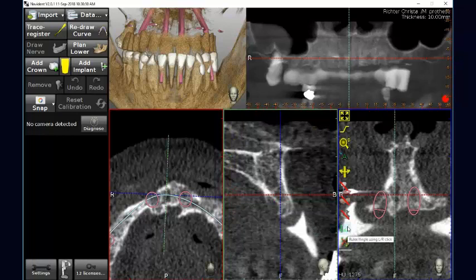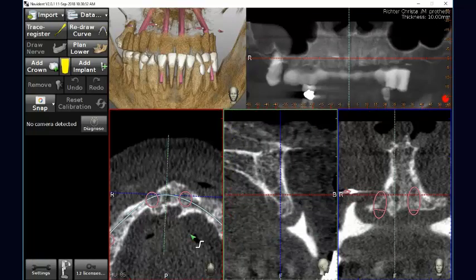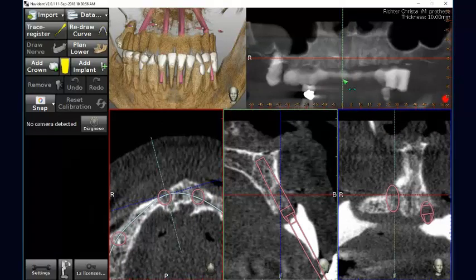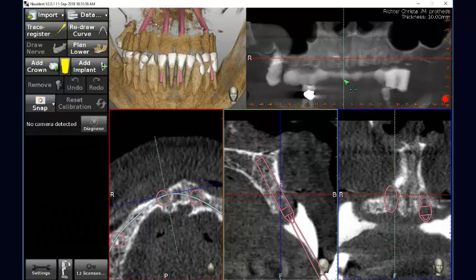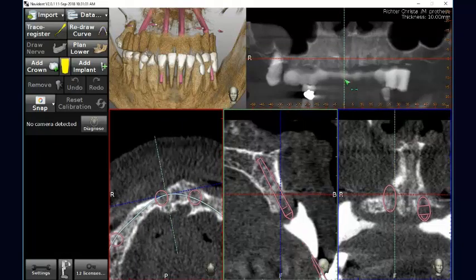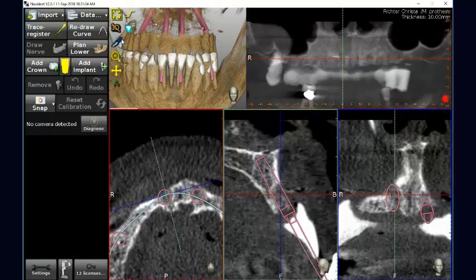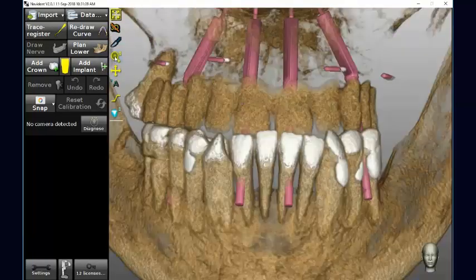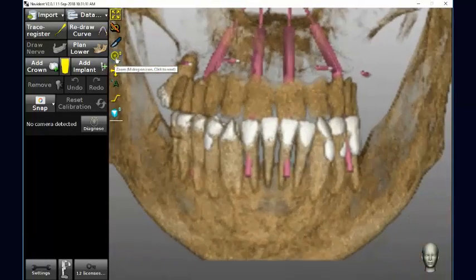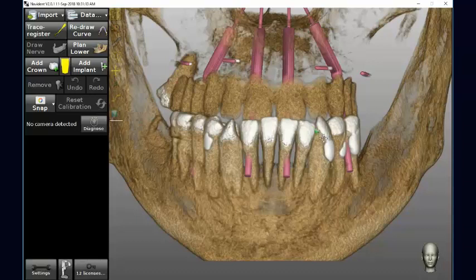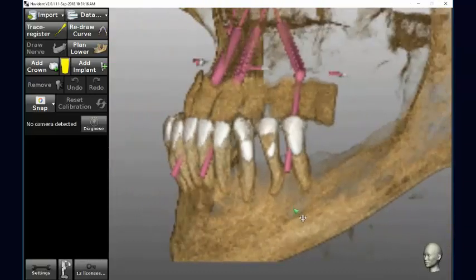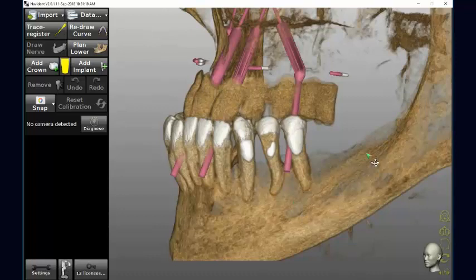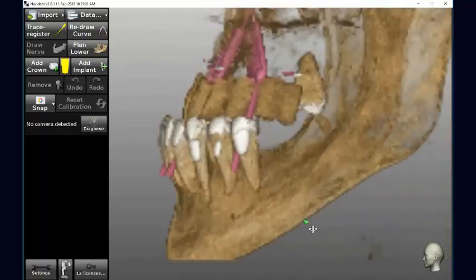We can then assess this matching on the 2D images until we find the shape of the implant, but we can also assess the whole thing directly on the 3D images. This allows us to make the final adjustment and final assessment, just before moving into dynamic navigation.